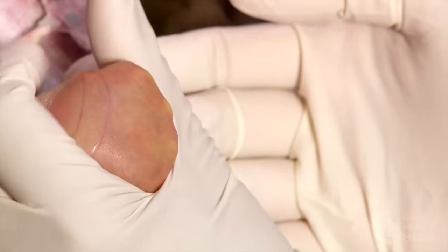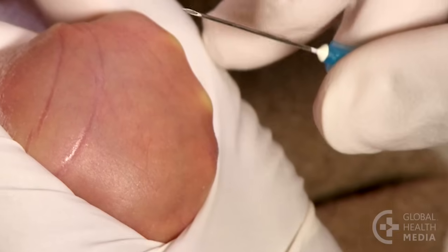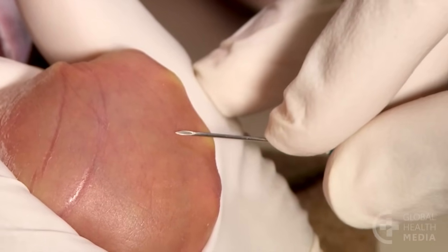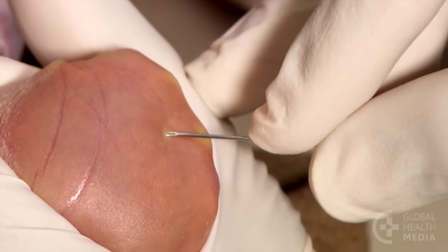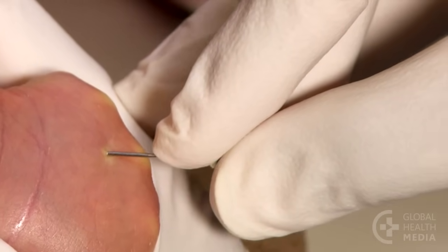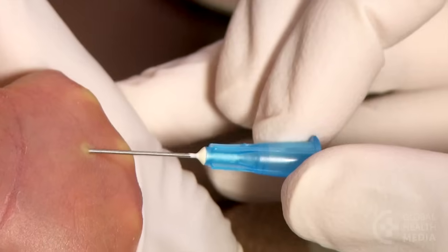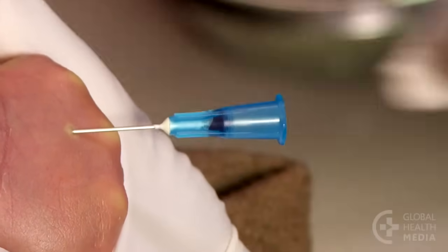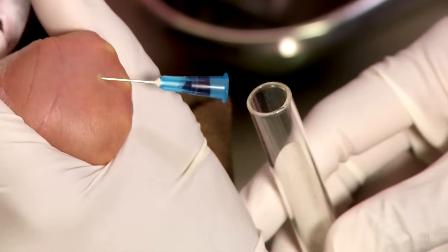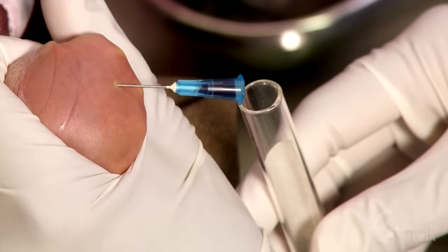Stretch the skin and hold it firmly. Then, taking a shallow approach, insert the needle through the skin with the opening facing up. Barely move the needle — just until you see blood coming. Hold the tube under the needle and gently squeeze the baby's hand to bring the blood.